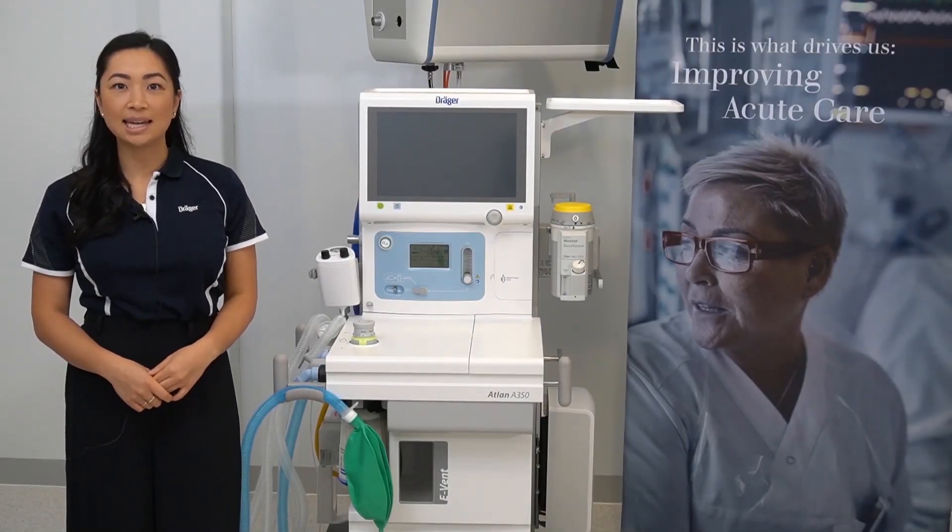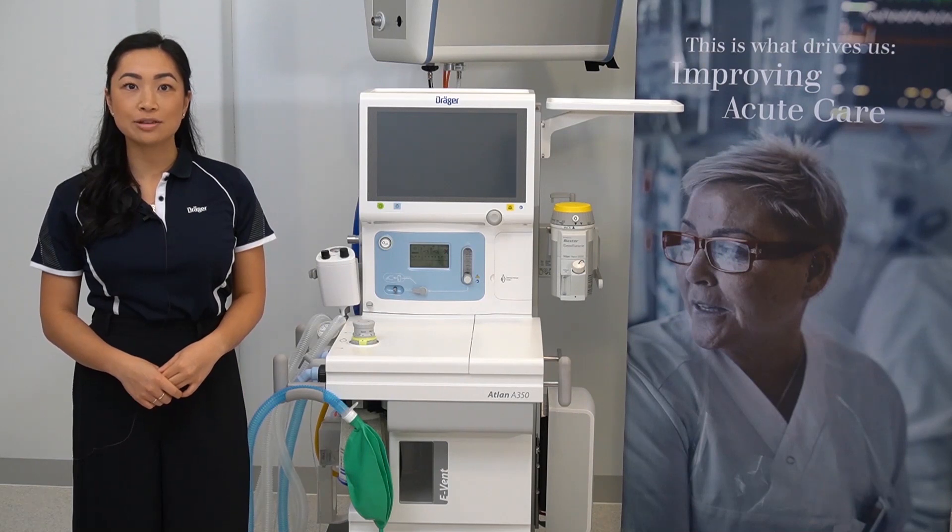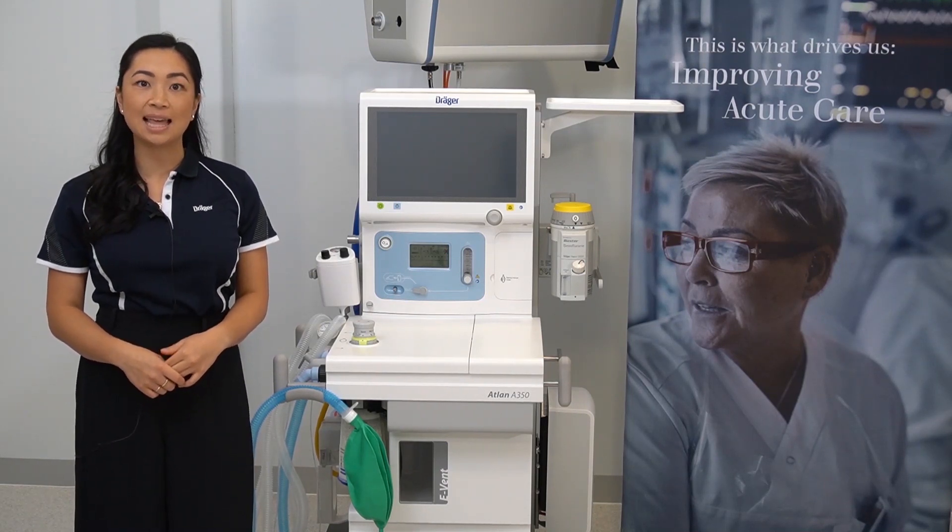Hello, my name is Samantha and in this video, I'll be walking the user through the system test for the ATLAN A350.